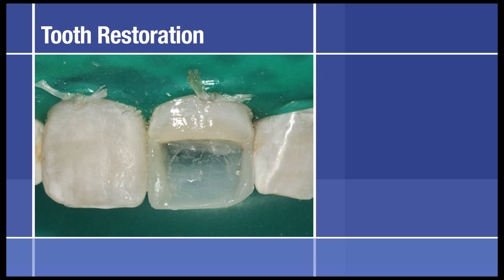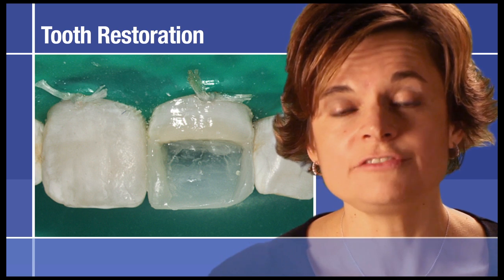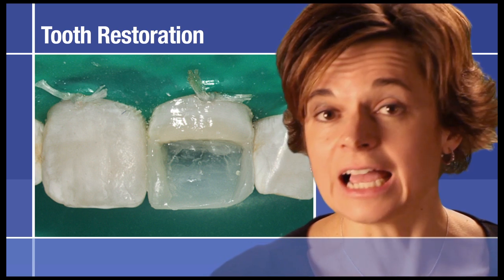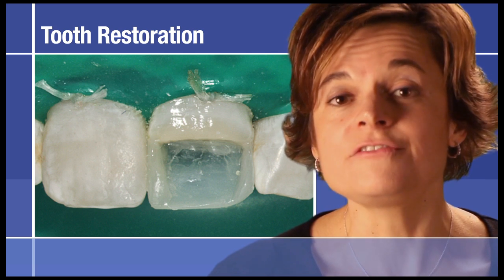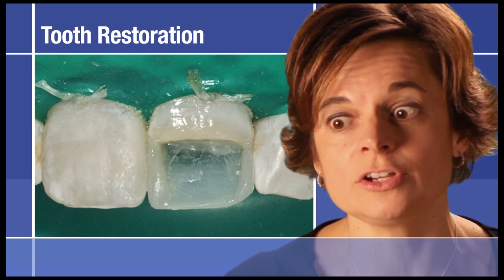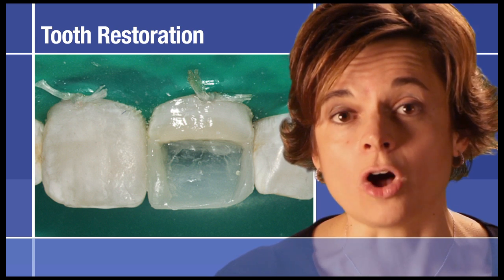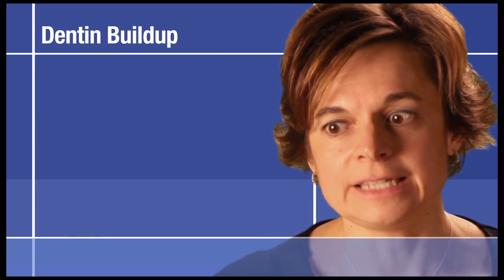So with the incisal view, we can clearly see now that we have basically an empty shell, but we already have good facial embrasures, good incisal embrasures as well. So it's just a matter of filling that now with proper opacity of material, but the contours are already there. We already have a lot of references. Dentin buildup will be our next step.